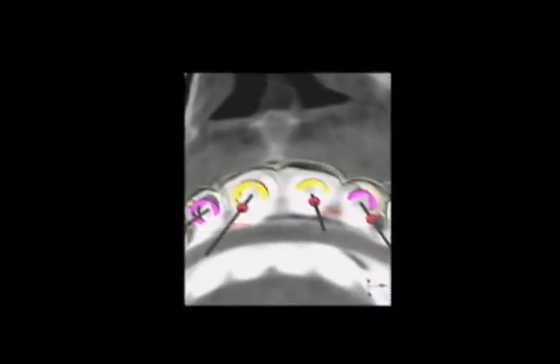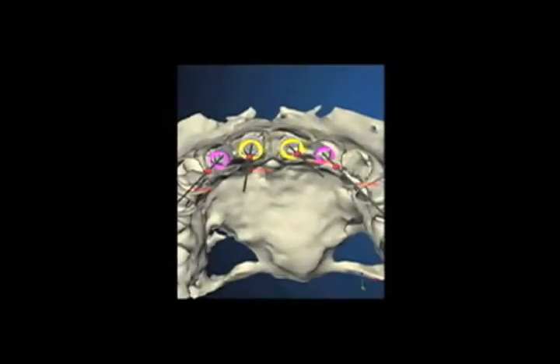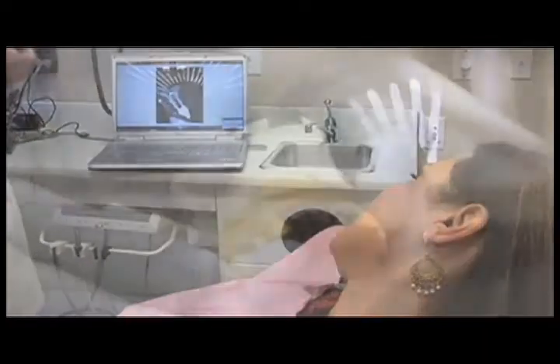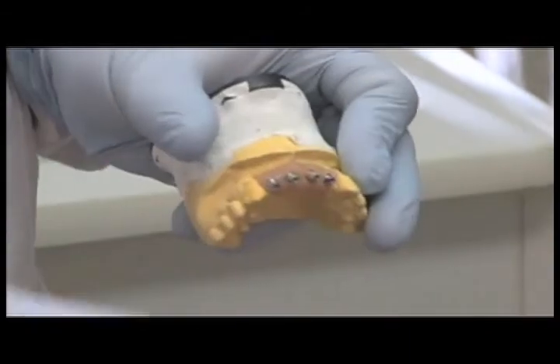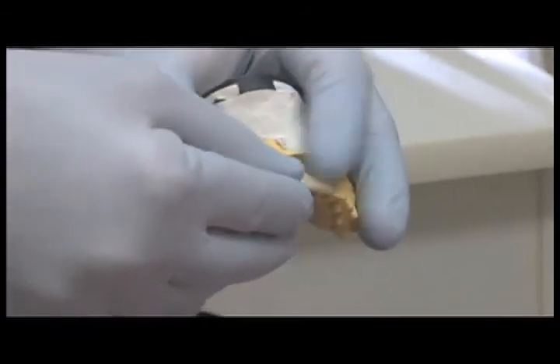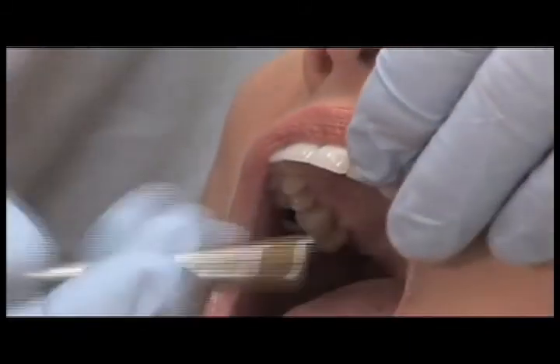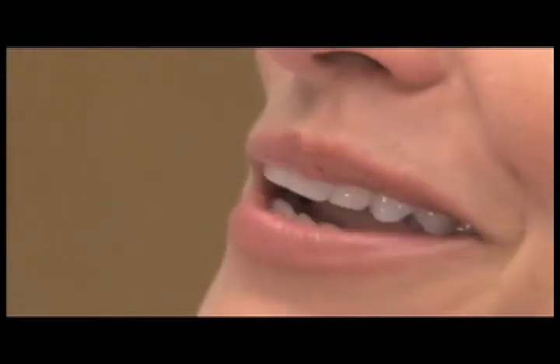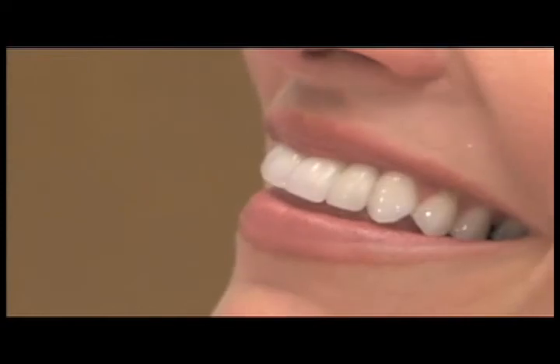First, the doctor does a CAT scan to get a 3D image of her entire jaw. Then a computer generates a blueprint of Jennifer's virtual smile. That blueprint is sent to the laboratory, where a complete model of perfectly fitted teeth are created. I was able to virtually place the implants and restore the teeth, actually make teeth, before we ever touched her. We placed our implants and gave her teeth that same day. In about an hour, she left the office with her smile intact.